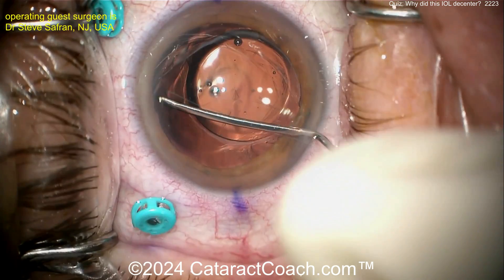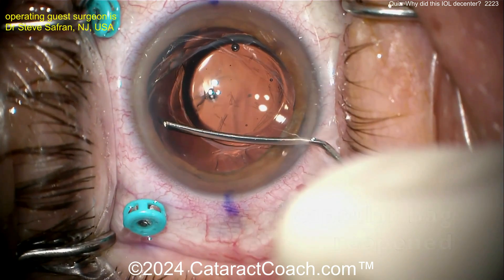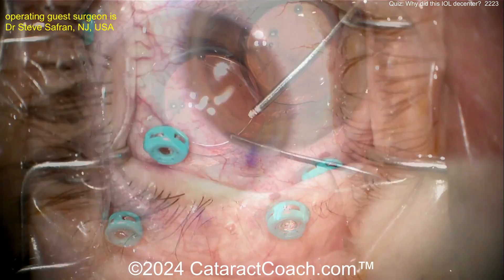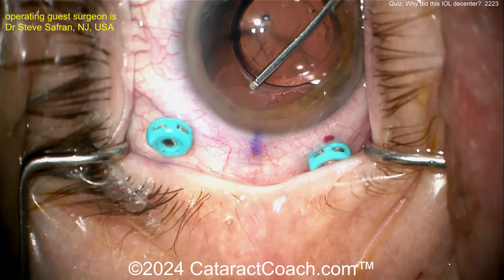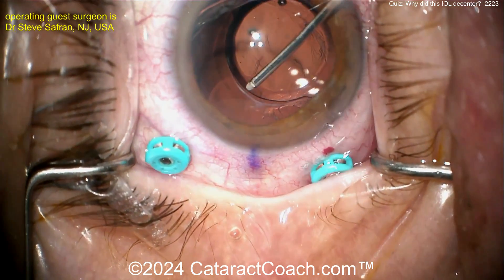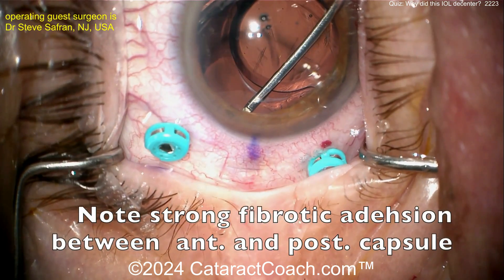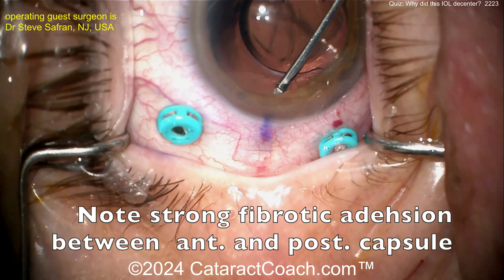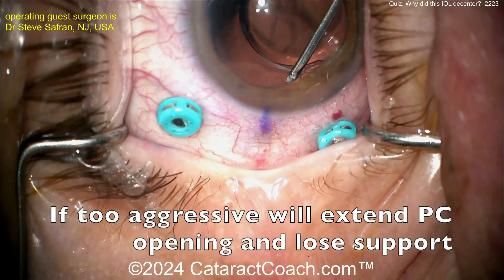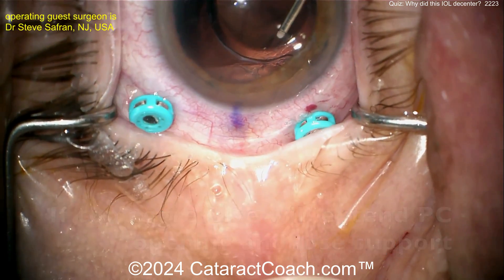Here's the haptic and capsule bag carefully dissected free. The one already in the bag is going to be dissected free as well. You really want to take your time opening up the capsule bag. A cannula is used to inject viscoelastic and also for blunt dissection — don't want to break the capsule with the strong fibrotic adhesion between the anterior and posterior capsule.